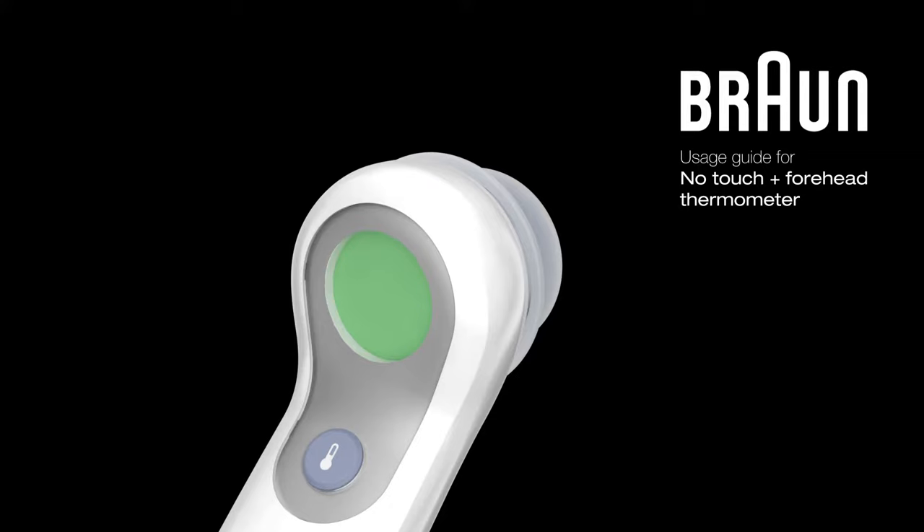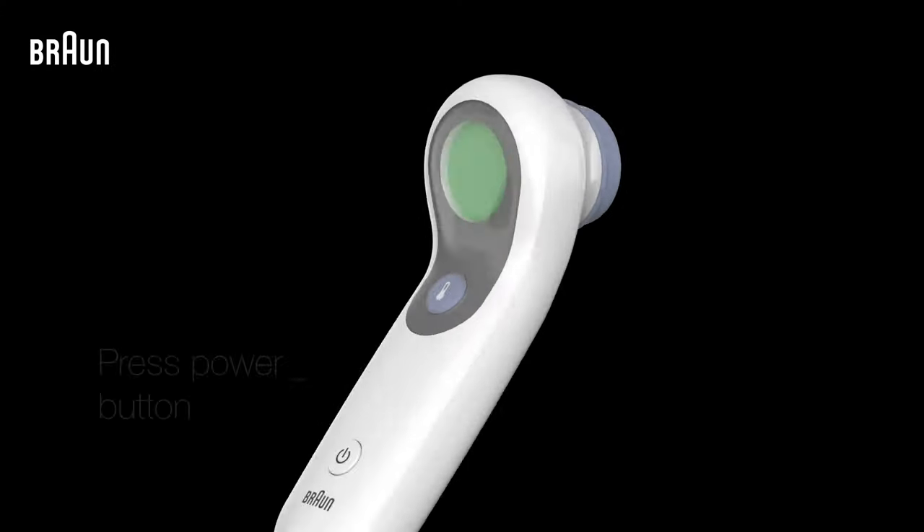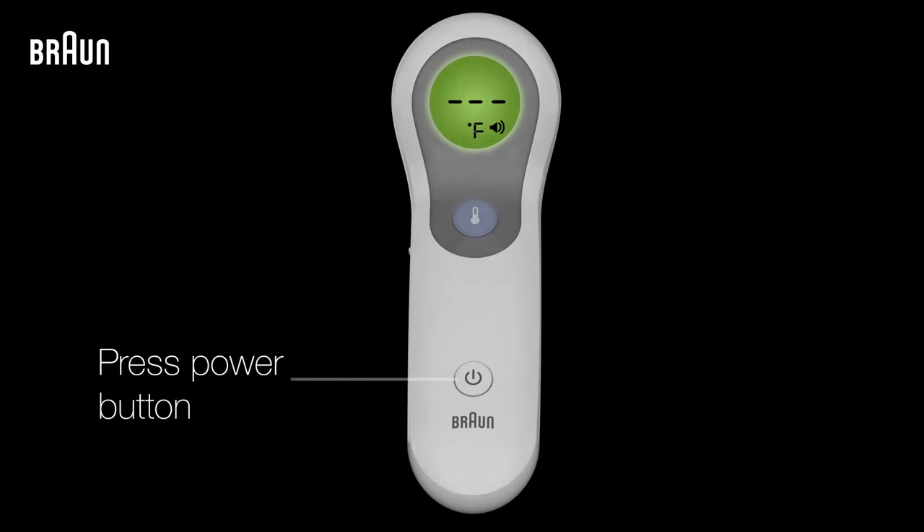Get started with your easy-to-use Braun no-touch forehead thermometer with only a few simple steps. First, remove the protective cap from the thermometer. Then, press the power button to turn it on.